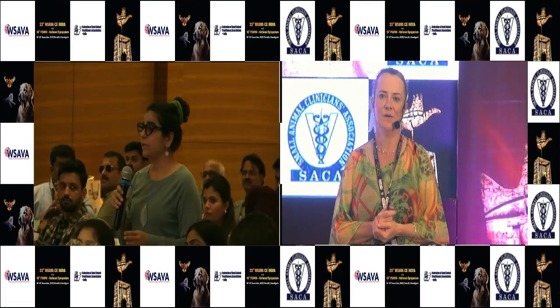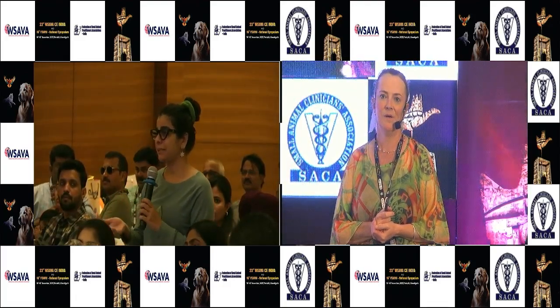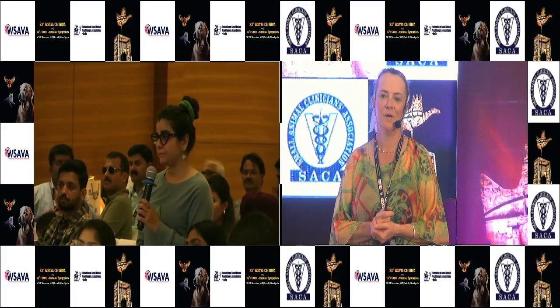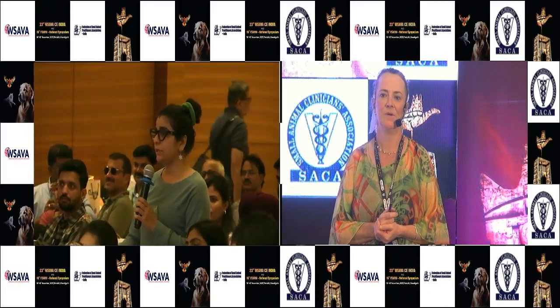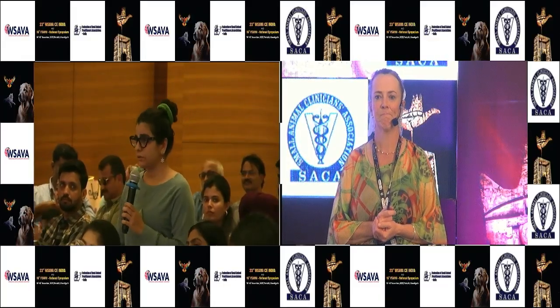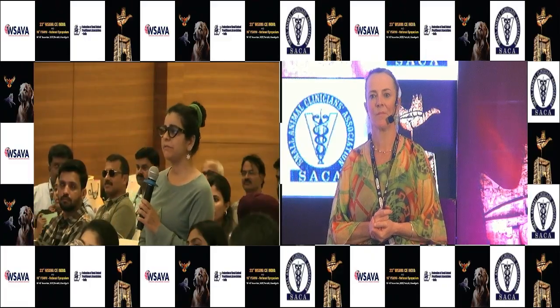The second time, when we anesthetized him, going in for surgery, we attached the multipara, and then suddenly we started seeing VPCs. It was not tachycardic. It was normal. And then suddenly the VPCs started happening, at least 5 in a minute. So we aborted the surgery. We sent for an echocardiography, and everything was normal.